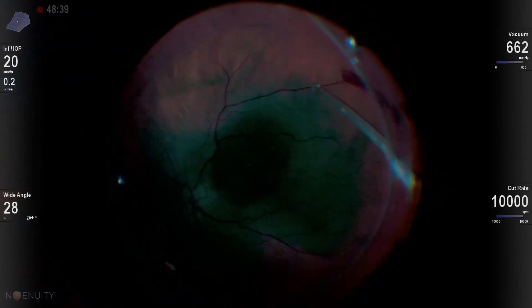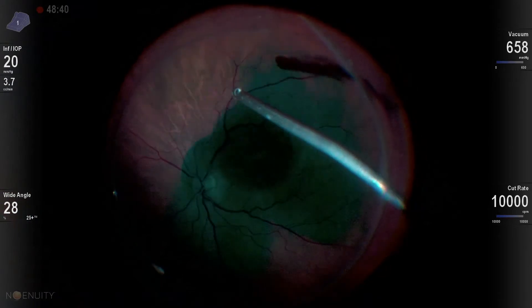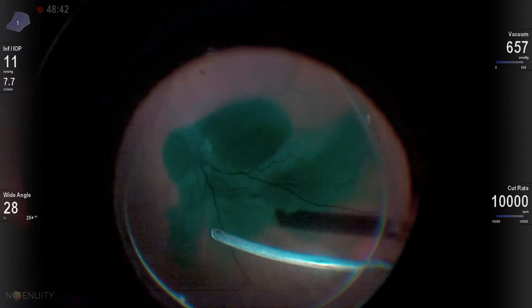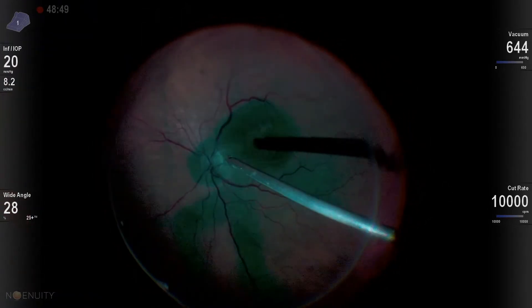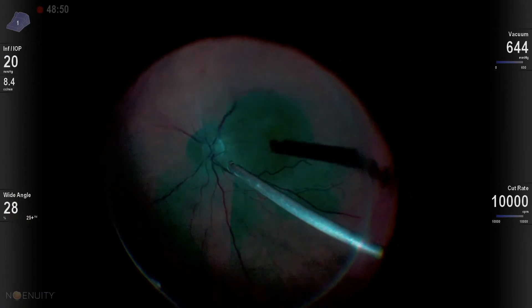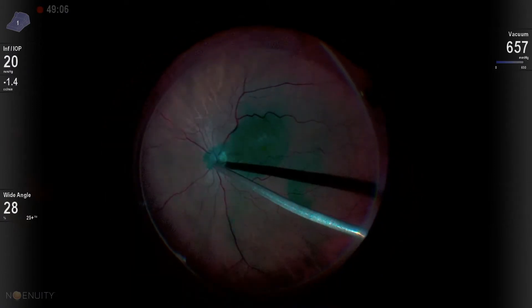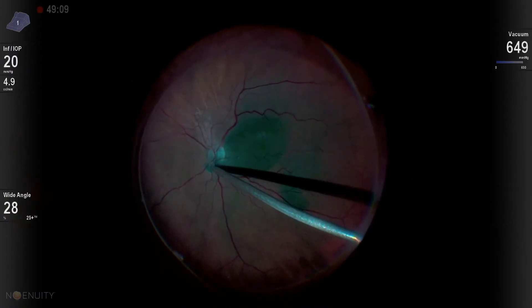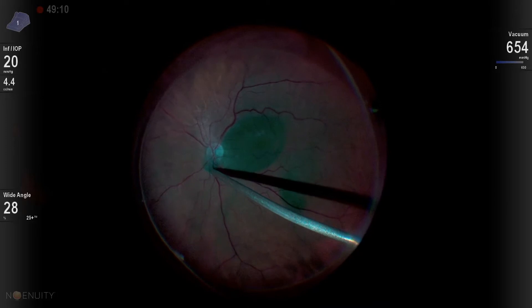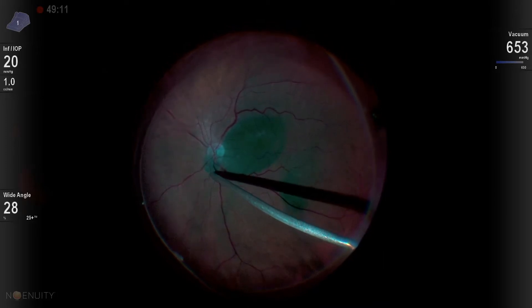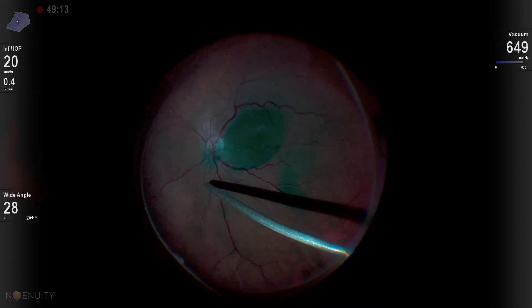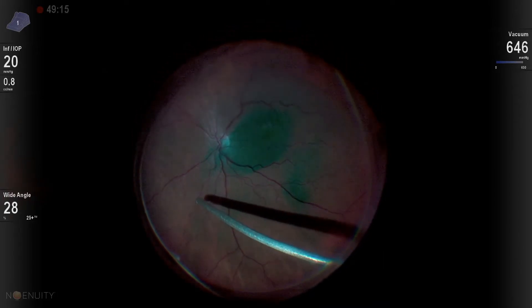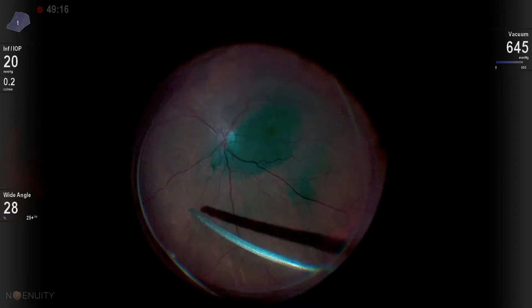I use the ICG primarily to stain the internal limiting membrane and negatively stain the epiretinal membrane, but it can also be used to identify the vitreous. And here I'm using it to identify the vitreous, and it actually assists me in aiding in the elevation of the vitreous.